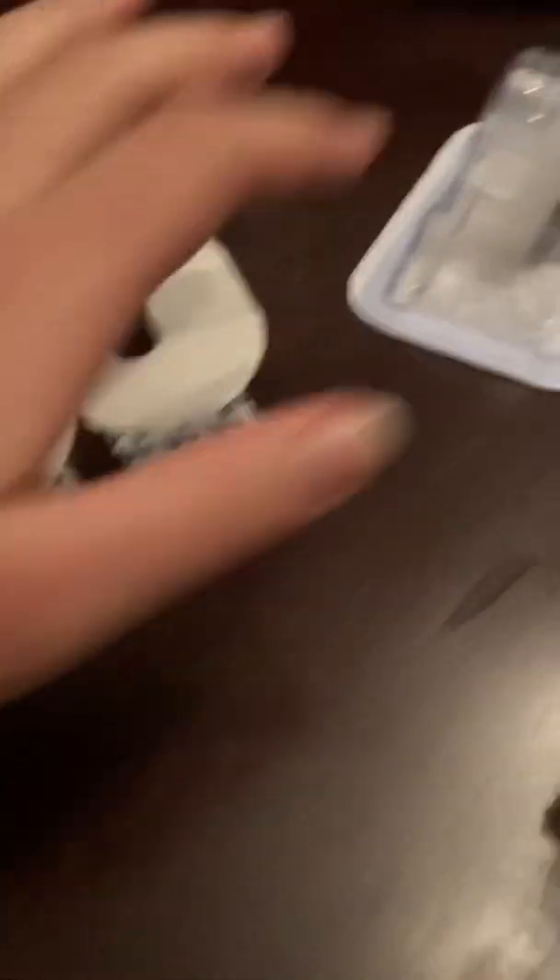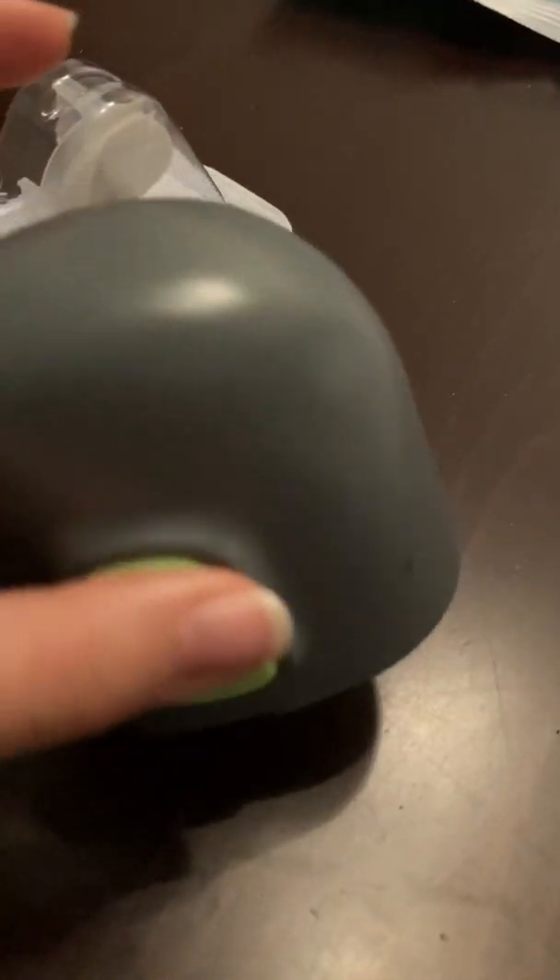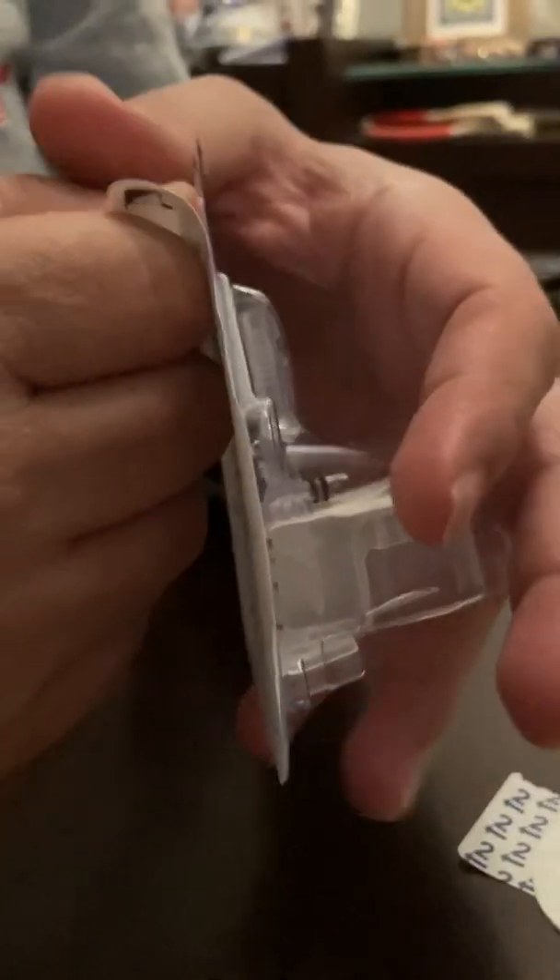Now we've got our equipment ready. This is our sensor, this is our attachment apparatus, and this is the transmitter with the charger. Now we're cleaning the skin of the upper arm to make sure it's clean. Then we open the sensor.